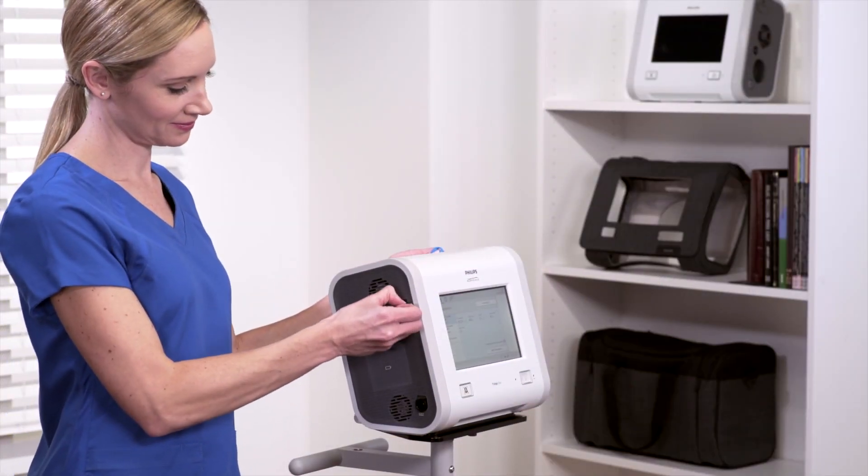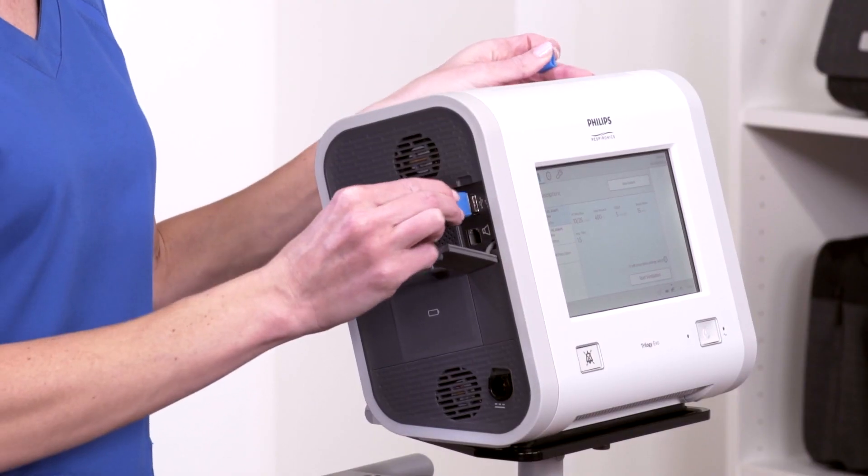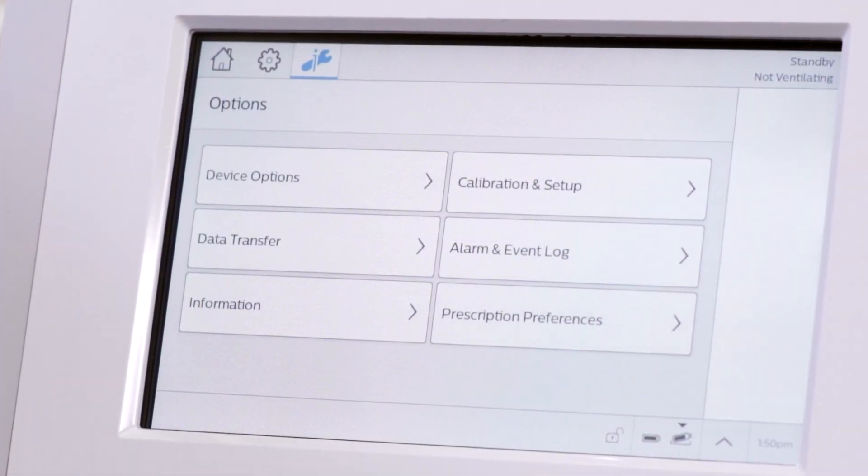The USB port is also used with a USB stick for data downloads and software updates. This is accessible via Options and then Data Transfer.